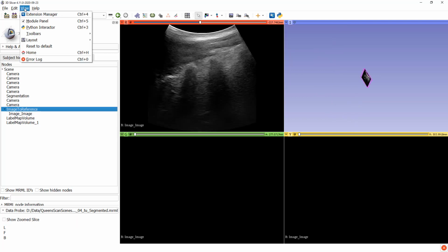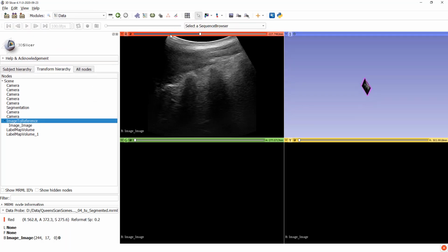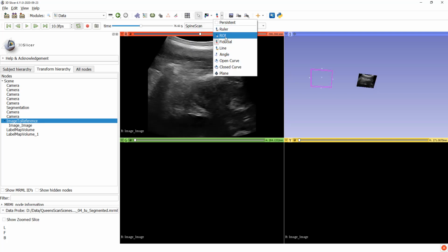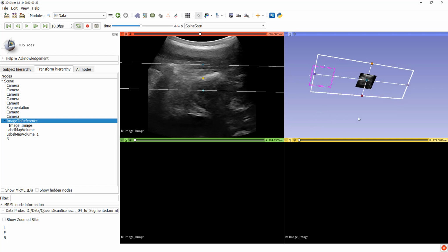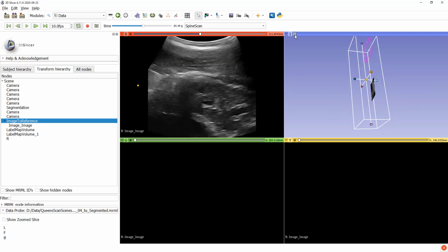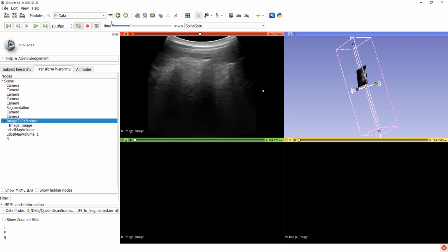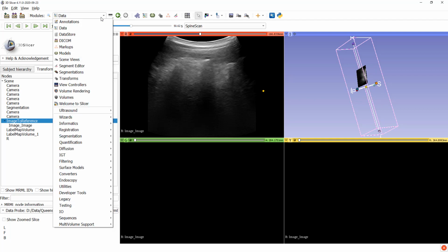So here I've loaded an example. Again, the image needs to be transformed by the image to reference transformation, and we're using the sequence browser toolbar to navigate in the time series of this ultrasound. Here we create a region of interest where the output volume will be reconstructed. If it's a live volume reconstruction, then we don't know how large the output volume is, so we need to define a region in space that will surely contain the area that we are scanning.